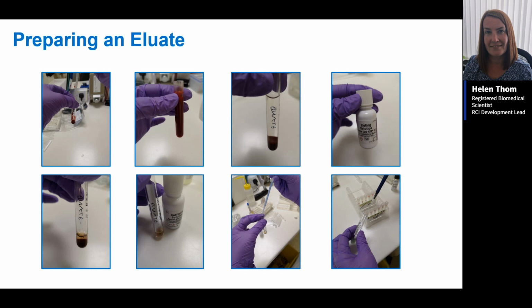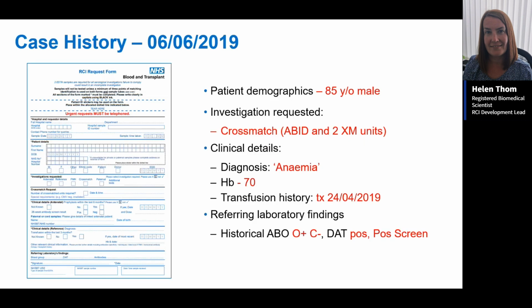Why do we use anti-IgG sera instead of IgM anti-sera? A lot of it's just down to the reagents and the type of antibody that you're looking for. If it tends to be an IgM antibody, you can detect it using IgM anti-sera. But if it's an IgG antibody, you would generally just tend to use IgG anti-sera because that's just the way that you've got it detected. I'm sure there's a much better explanation than that. So if everyone's okay there, I will just move along.